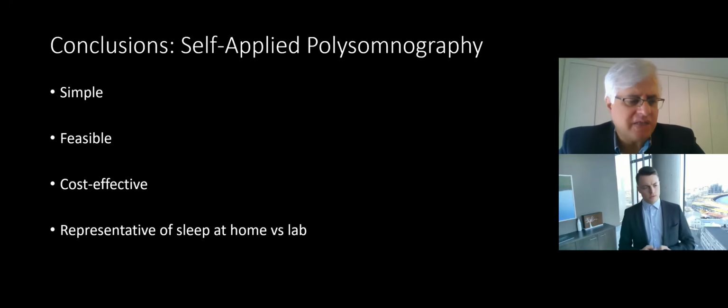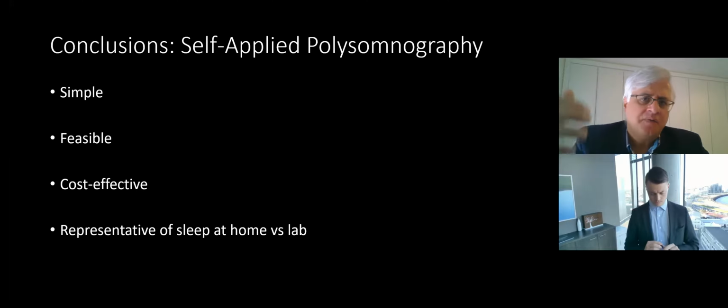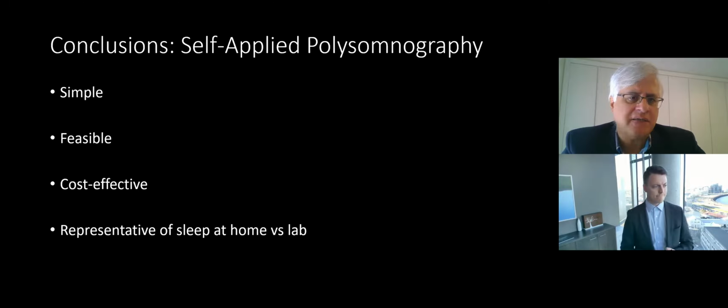So what are the key messages that I'd like to leave you with from our experience? And I can go into much, much more detail about these findings. From our experience, we clearly can see that this is a simple approach. There are techniques that are available that we've developed and Nox has developed to make it relatively simple. We think it's extremely feasible, and we've shown that from the standpoint of how many successful studies you can get on the first attempt, what's your bump up in success if you were to do it twice, and so forth.